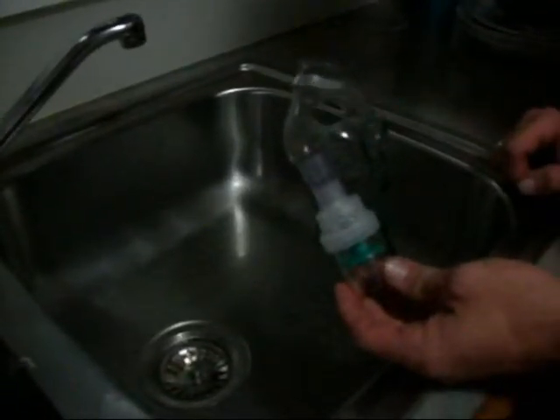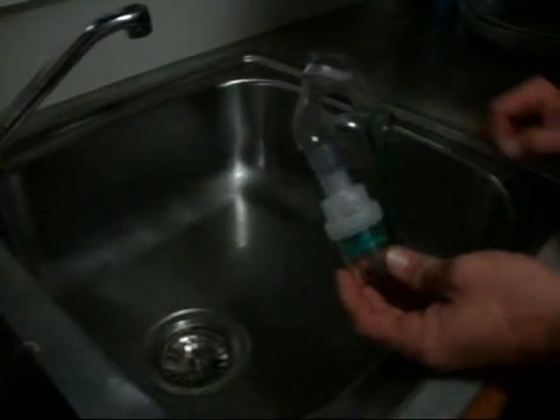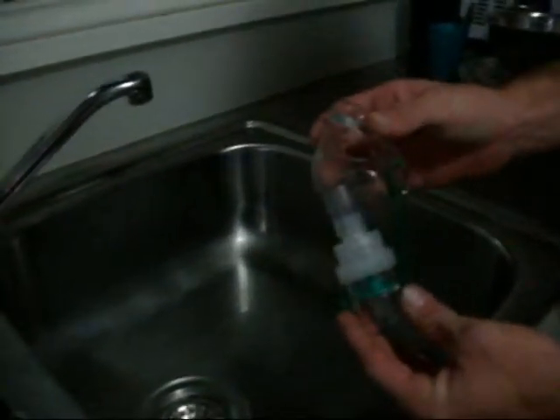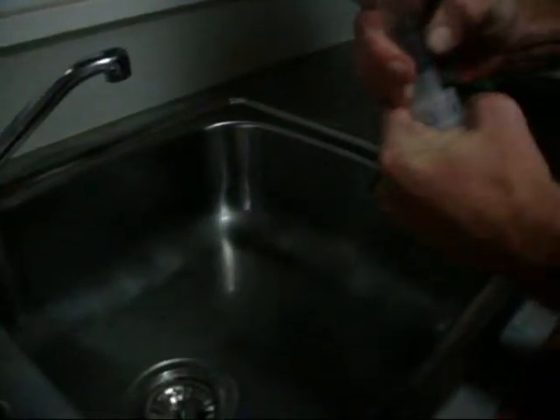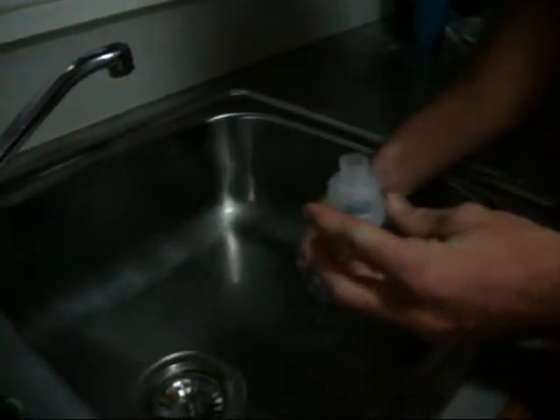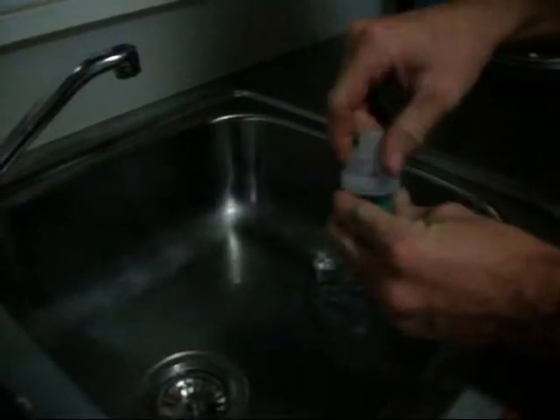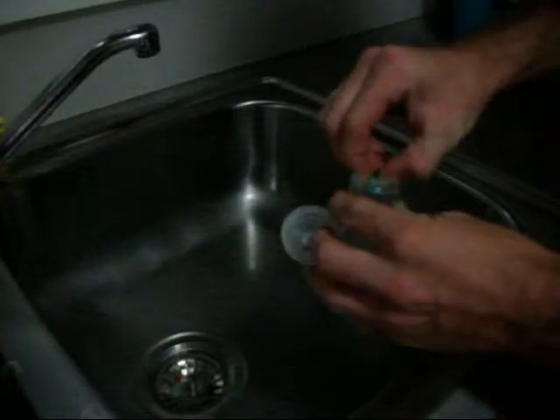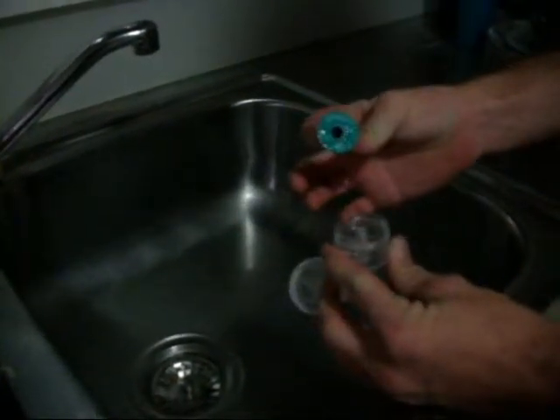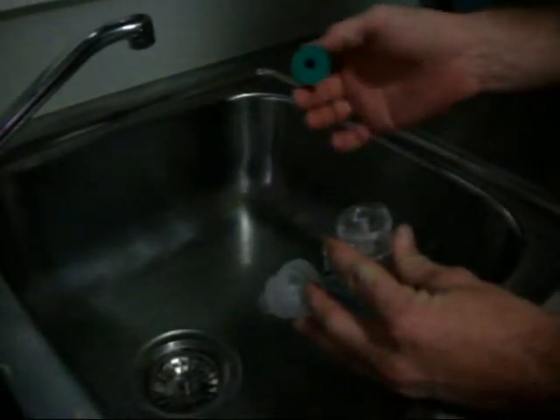After the dosage has been administered, it is a good idea to have both the mask and the canister washed. Removing the mask, a simple twist will help, and the canister, ensuring to remove the vaporizer and washing the lot.